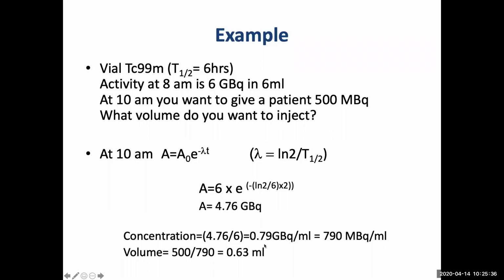But for sure, we go to the dose calibrator and measure our dose, because this is an estimation. Then we confirm our dose. But this is what is done every day, for each patient in nuclear medicine. The technologists do that, but in a quick manner.